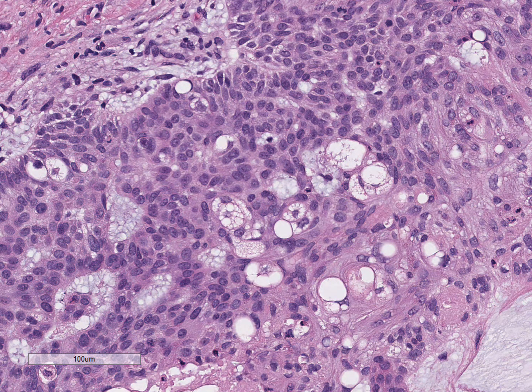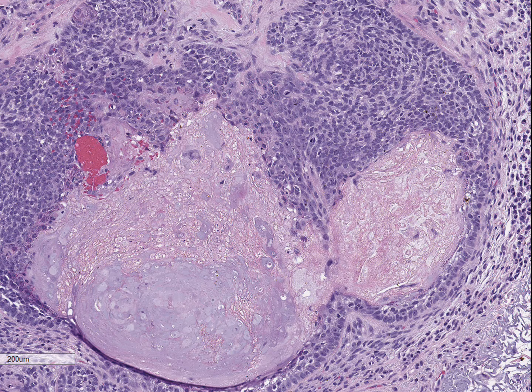This is another BCC showing sebaceous differentiation, which is characterized by basaloid cells admixed with multivacuolated mature sebocytes, and this entity is seen in a syndrome known as Muir-Torre syndrome, and they can show some overlap histologically with other sebaceous neoplasms.